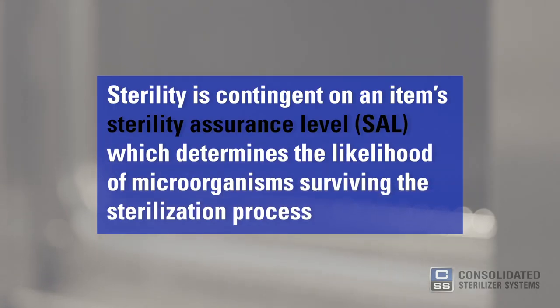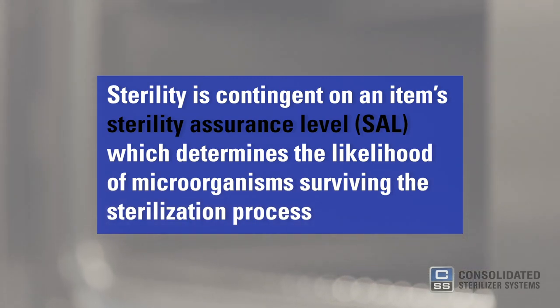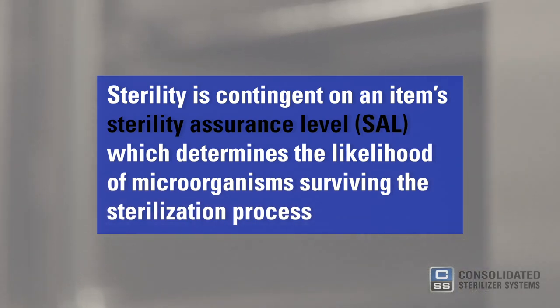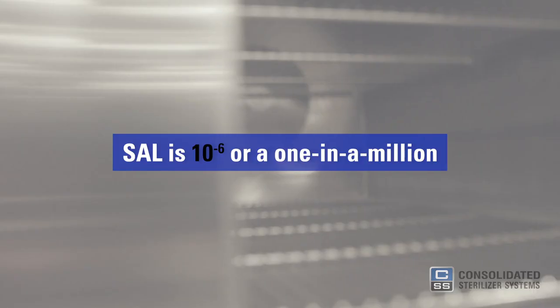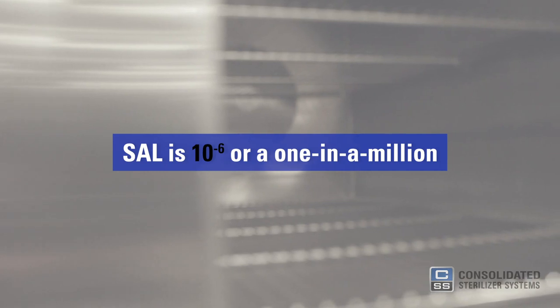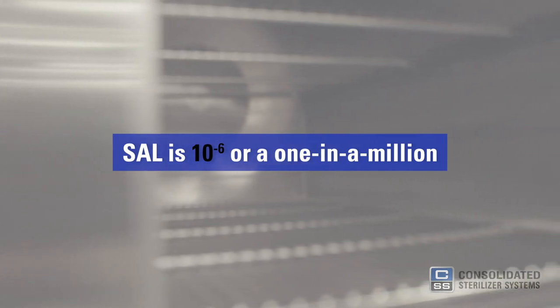Sterility is contingent on an item's sterility assurance level, or SAL, which determines the likelihood of microorganisms surviving the sterilization process. The general standard for SAL is 10 to the negative 6th, or a 1 in a million chance of a single viable microorganism surviving.